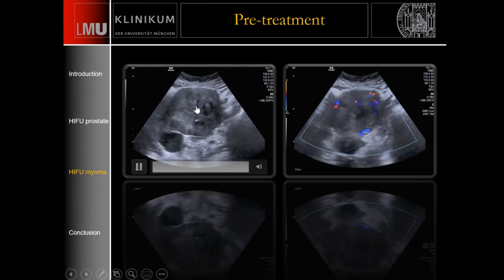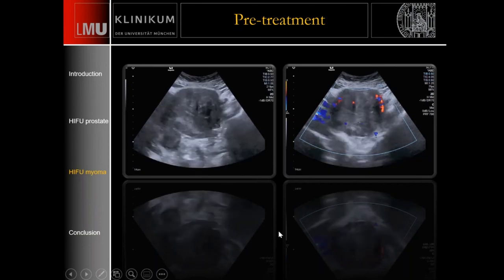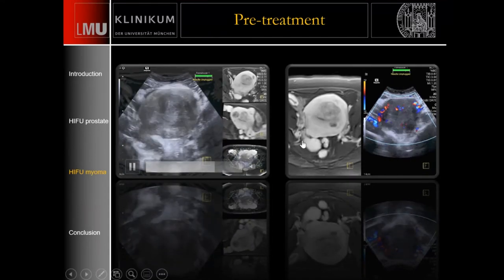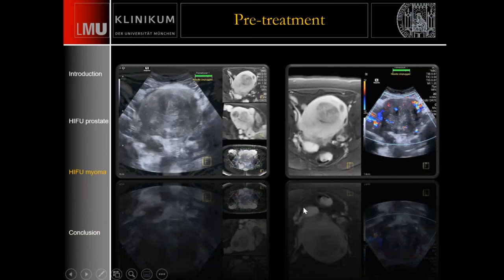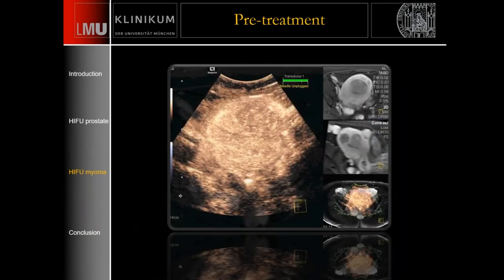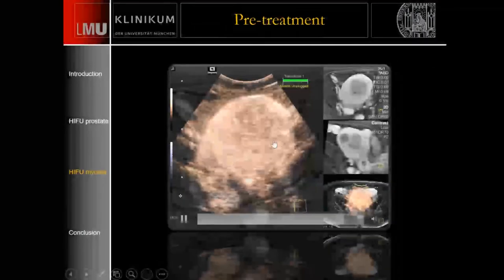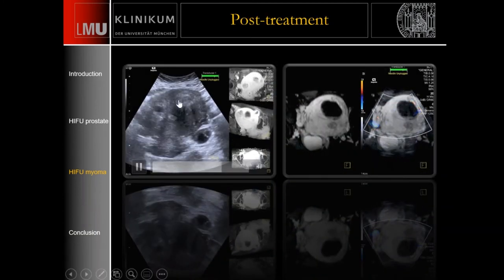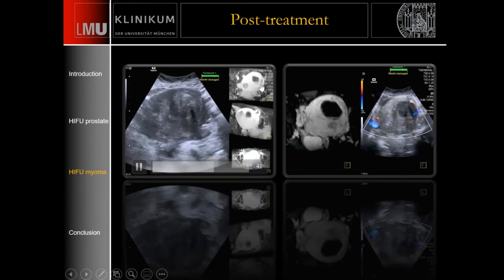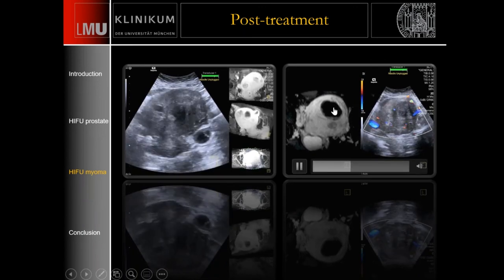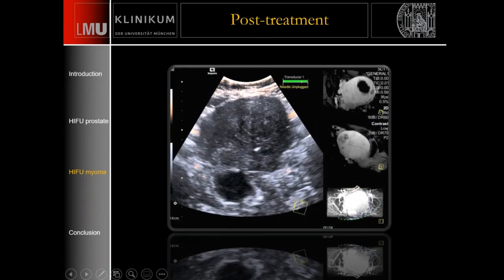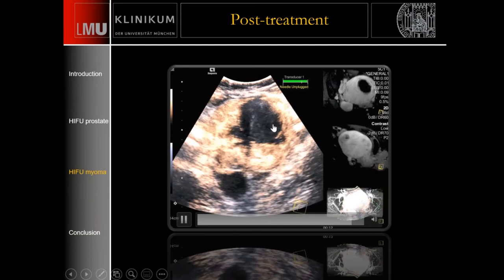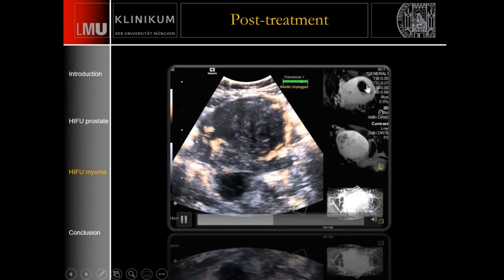We see a myoma inside the uterus with a couple of vessels. By fusion technique, we identify multiple myomas and decide to treat the large one. Some peripheral vessels are present. The myoma has perfusion similar to what was seen on MRI. After HIFU treatment, the grayscale in the myoma changes. On MRI, necrosis is present, and Color Doppler cannot detect any vessels inside. On contrast, the uterus shows nice perfusion but the myoma shows a perfusion defect corresponding to the MRI findings.